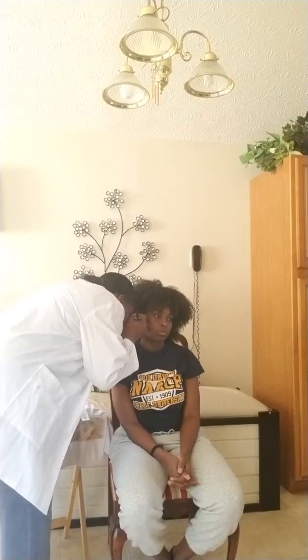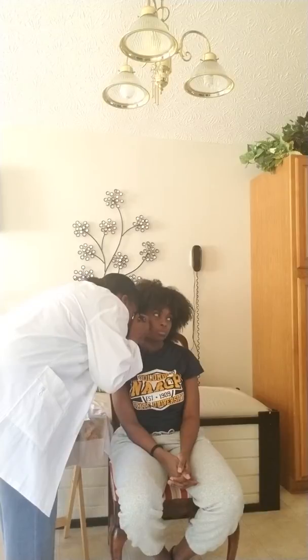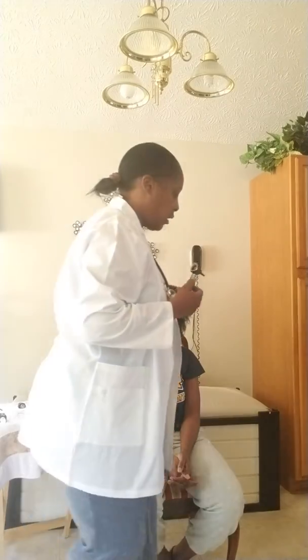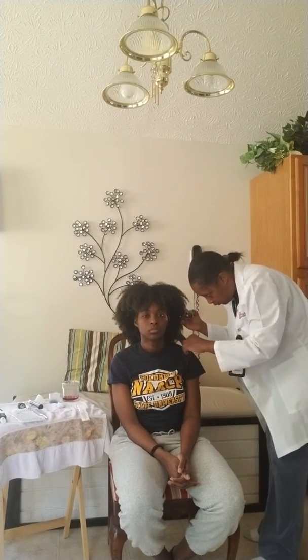Now I'm going to look for the eardrum and the cone of light. And I'll be looking for all the landmarks. And I do see the cone of light. And I do see all the landmarks that are associated with the ear canal, the malleus and the other bones. And then I'm going to check the left ear.